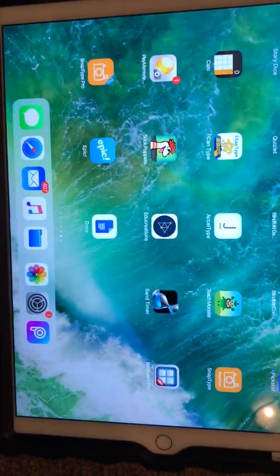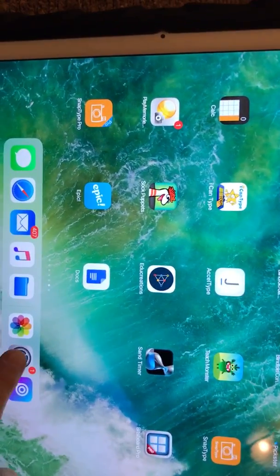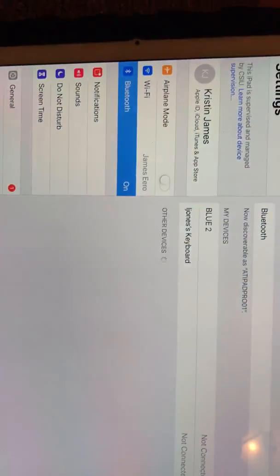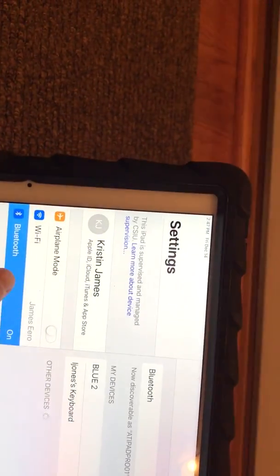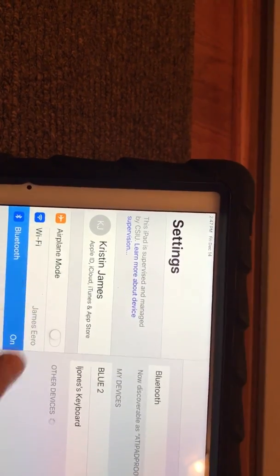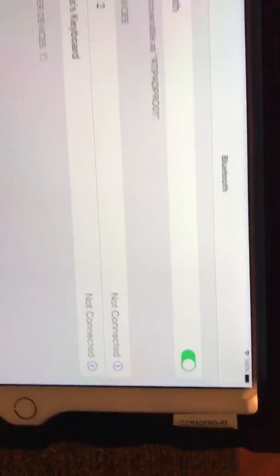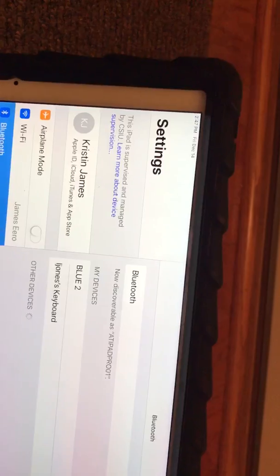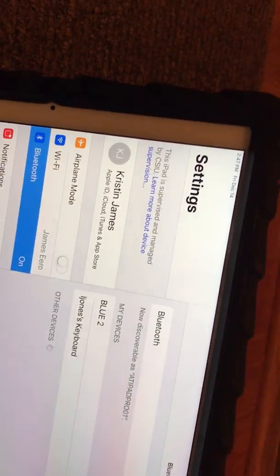The next thing you need to do is go to your iPad, find your Settings button that has the gear on it, and then go to your Bluetooth settings and make sure they're turned on. Next, look on your Bluetooth switch.